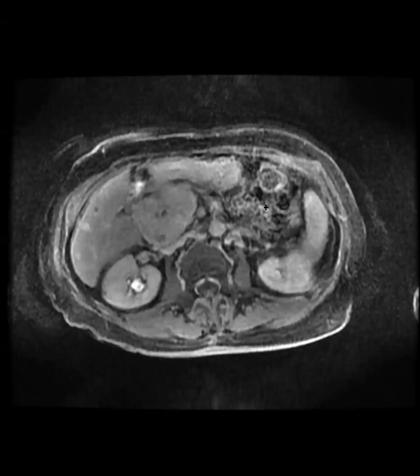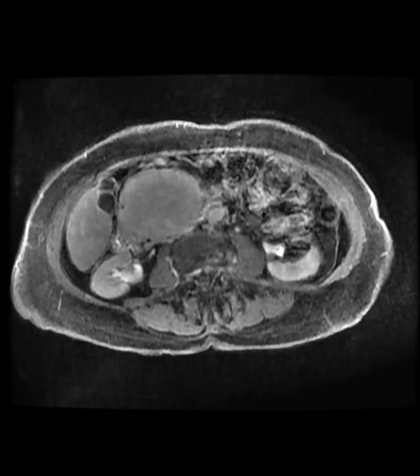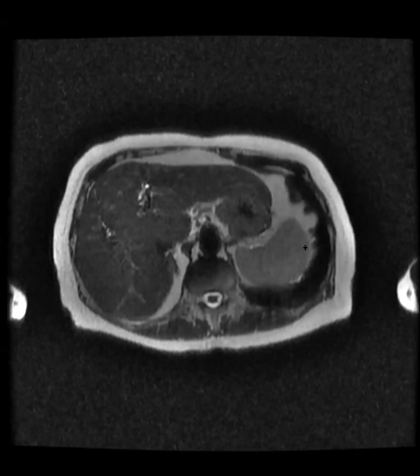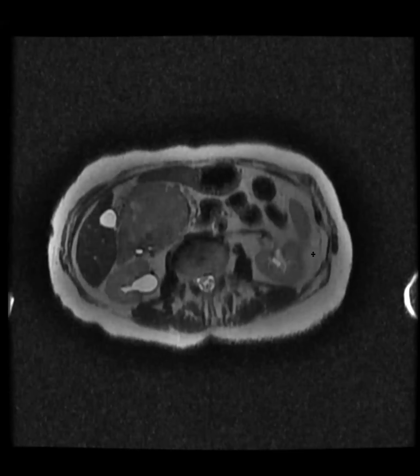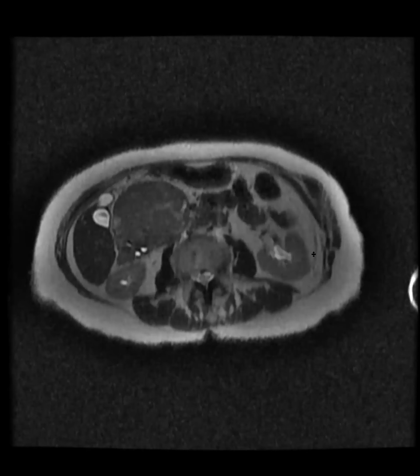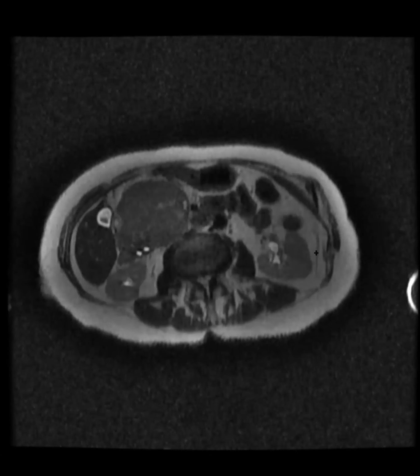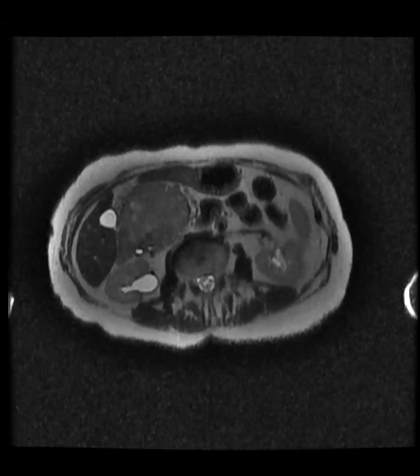I don't think I would ever put that in my differential. But now that we've seen one, we kind of have an idea. Wait, can you go back to the T2? Yes. If it was darker, maybe we would have brought it up. I don't think it would ever preclude tissue diagnosis in this case. Agree. I was also thinking we could put in the differential paraganglioma and schwannoma and stuff. Great thoughts.